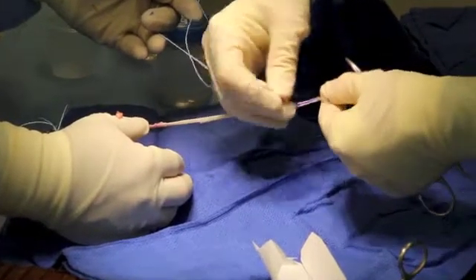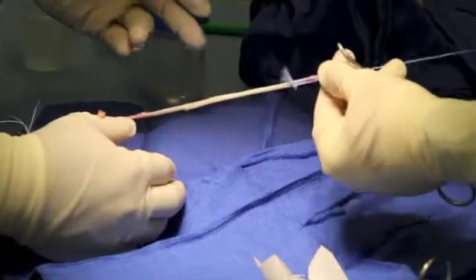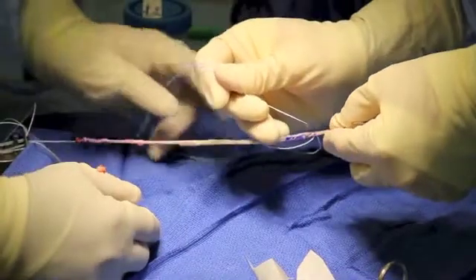First, the gracilis is whip stitched at the free end. After the whip stitch is complete, excess graft can be trimmed.